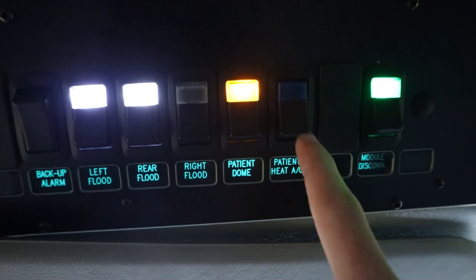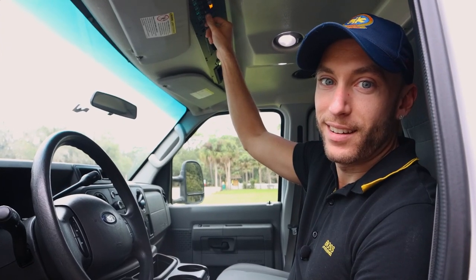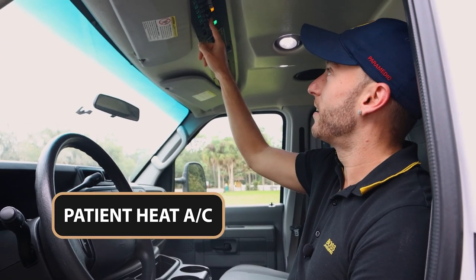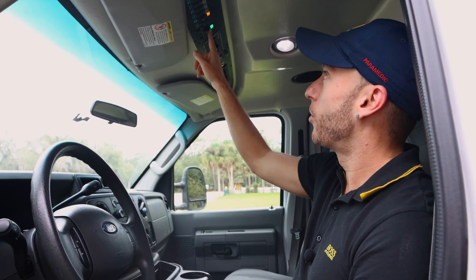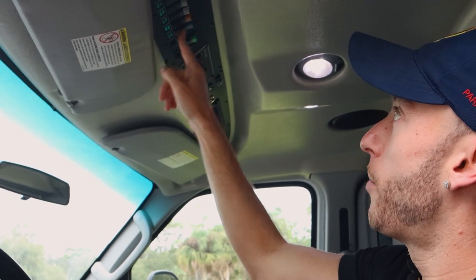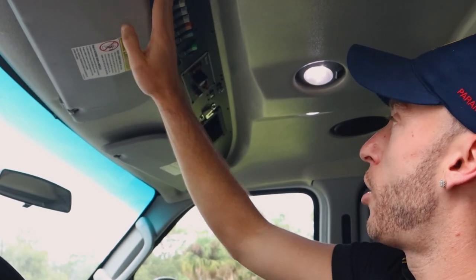You can probably hear that — that's for the patient heat and AC. Nice to put that on for your patient. And then if I want to shut everything off in one click — boom — I like to have everything clean, shut off and in the off position.